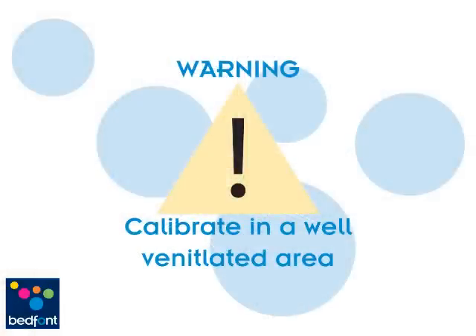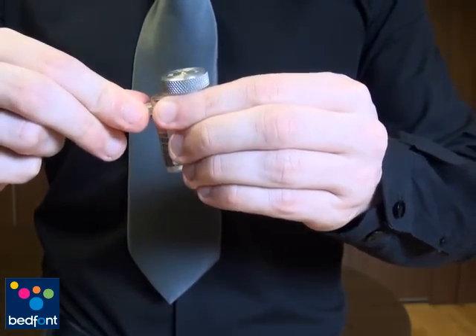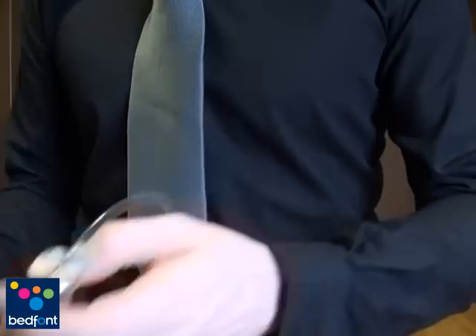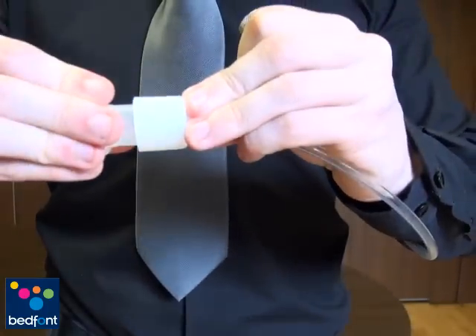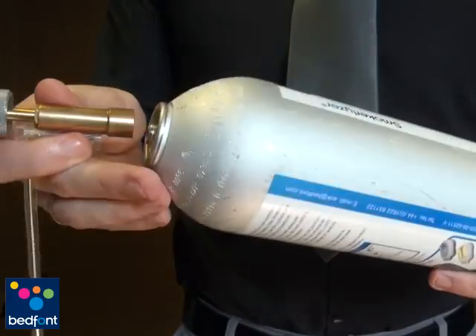Please do this process in a well ventilated area as carbon monoxide is a harmful gas. Connect the fine control valve and flow indicator to the calibration adapter as shown. Place the calibration adapter into a D-piece. Ensure that the fine control valve is in the off position before threading it onto the gas canister.